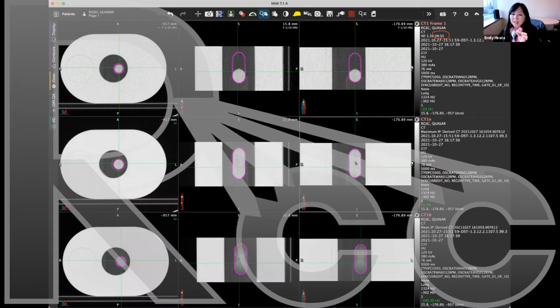So basically maximum intensity is your ITV completely filled in as if the whole thing was a static tumor shaped like this. And then this is the average or mean IP. And as Ben explained really nicely, it takes into account how much time the tumor is in the space. Sorry, I'm talking about the third row, where my pointer is black. The correlated pointer on the top two rows is blue. So I'm talking about down here. This shows, time-based, where the tumor is located.